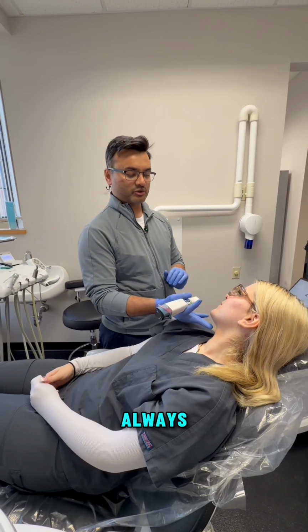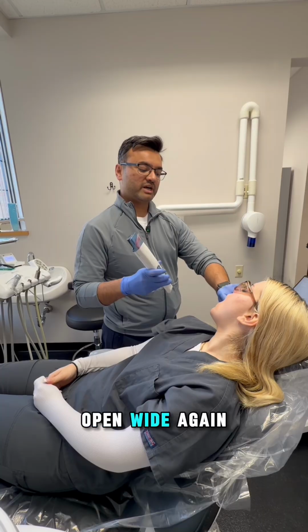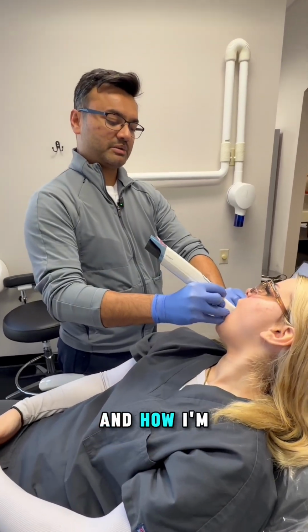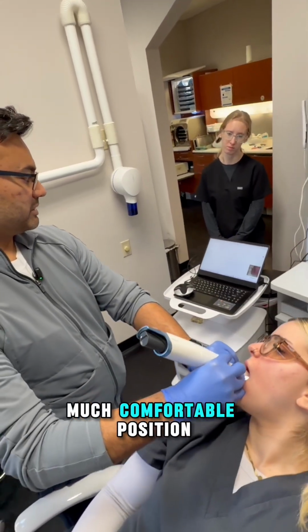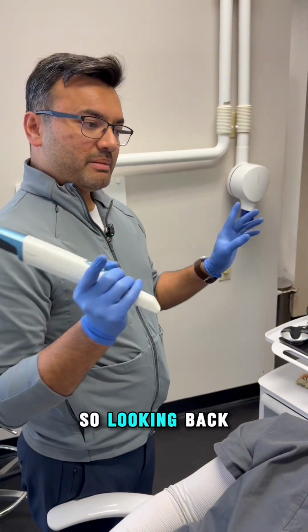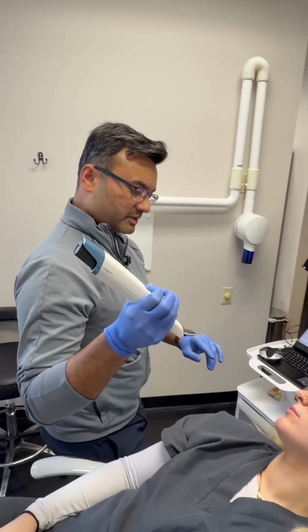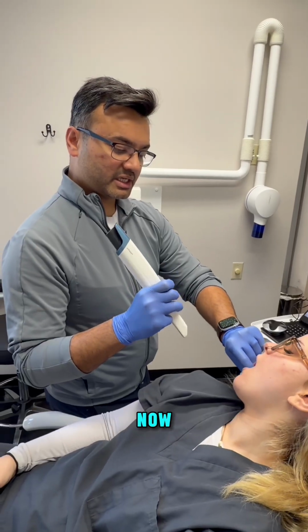So I will tell the patient always open wide and lift your chin up to the sky. Good. And now open wide again. And look how I am standing now and how I'm starting to scan, in a much more comfortable position. So looking back at our previous video, think about the concepts again. Open wide, patient towards me, relax your cheeks now.